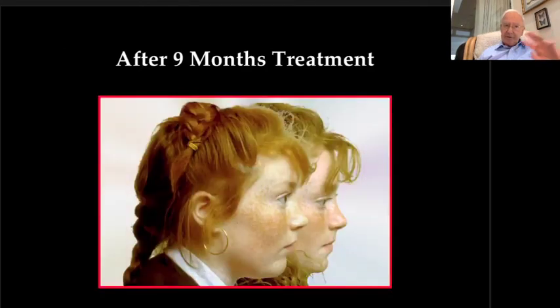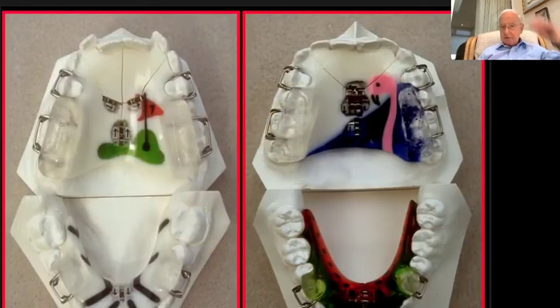So we simplify the fixed appliance treatment by combining with the twin block phase. Most Class 2 Division 2 malocclusions have a brachyfacial growth pattern with a Class 1 or mild Class 2 skeletal base. It is not necessary to advance the mandible significantly to achieve a straight profile. For that reason, the construction bite is edge to edge on the incisors, and the appliance is designed to advance retroclined incisors.